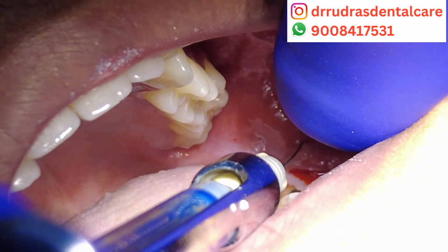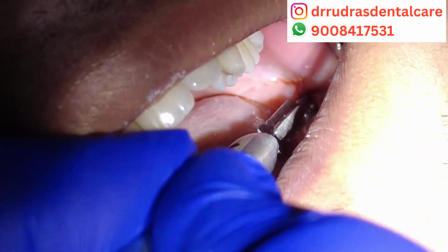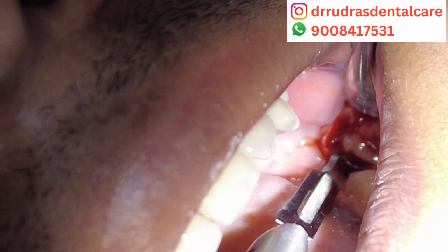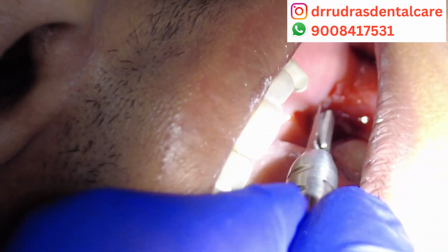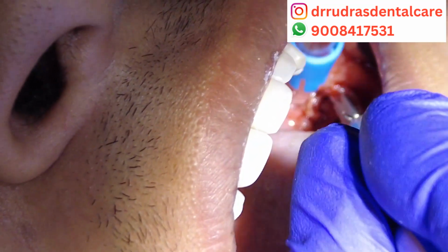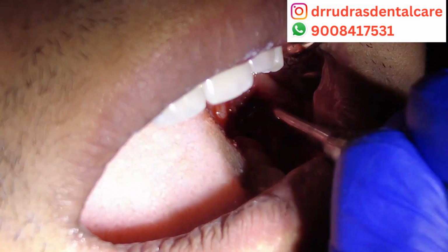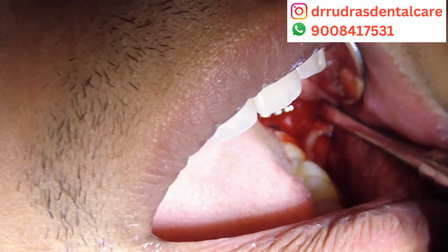Now you can see we are using a number 15 surgical blade to lift and elevate the mucoperiosteal flap. This is used to gain access to the impacted tooth, tooth number 3/8. Now we are using the blade to further extend the flap and retract it, doing the sharp dissection, which will be followed by the blunt dissection using the periosteal elevator. As you can see, there is a lot of bleeding because there was a lot of granulation tissue, and we are suctioning the blood out.